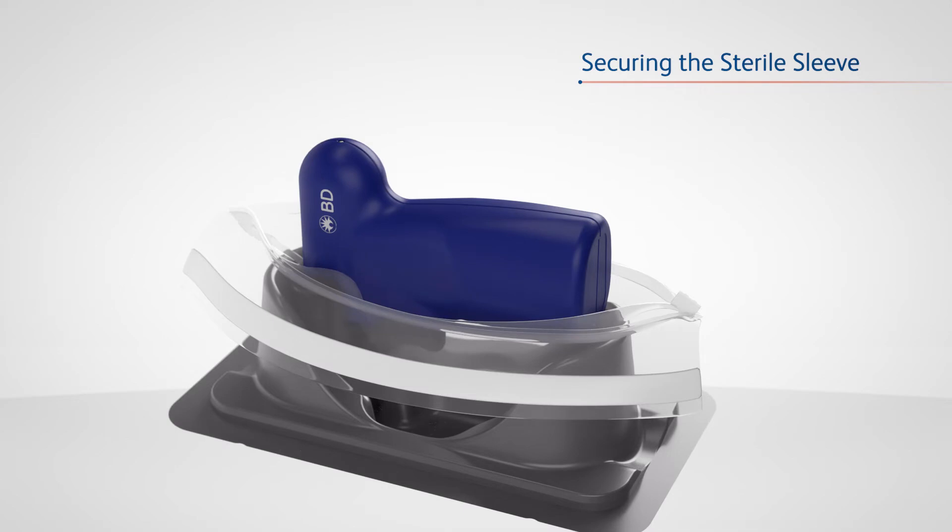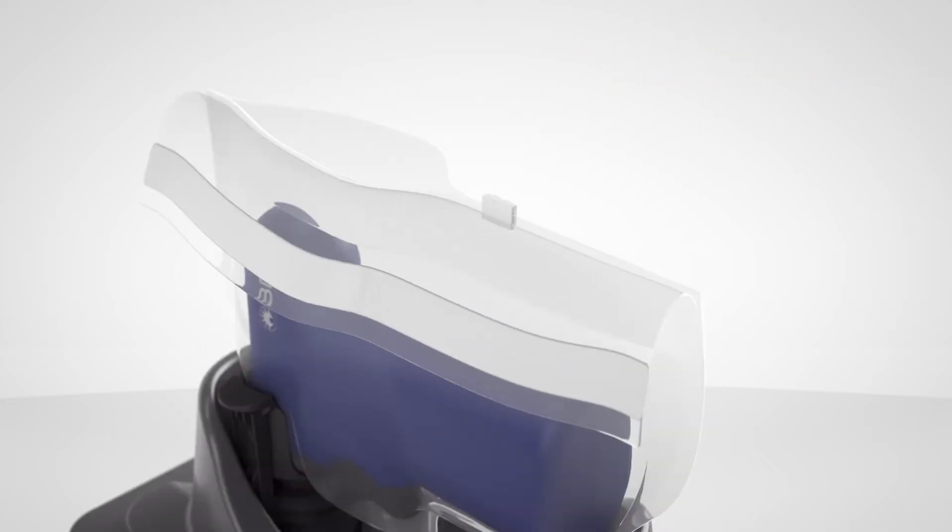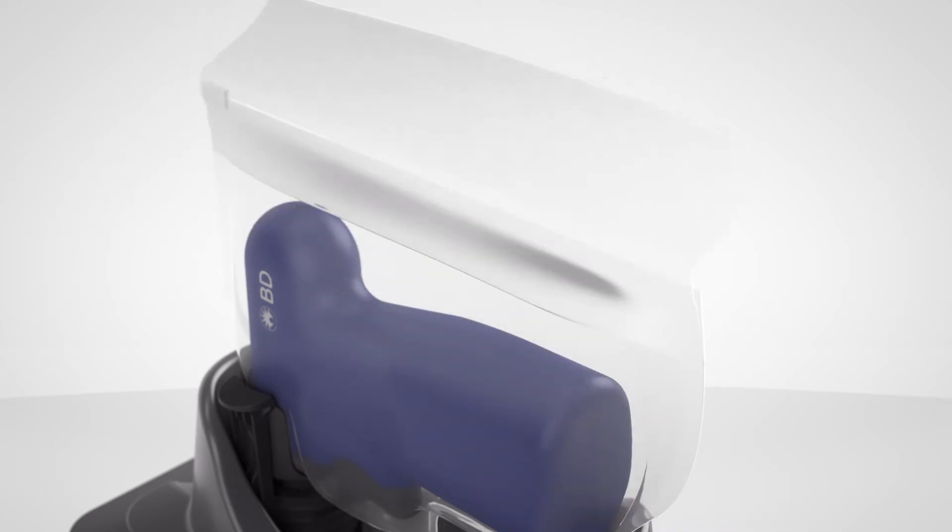The sterile sleeve features a zip closure and adhesive strip for secure and easy setup. Pull up the sides of the sleeve and seal the sleeve with the zipper. Peel the paper backing from the adhesive strip and fold the flap onto the sterile sleeve.